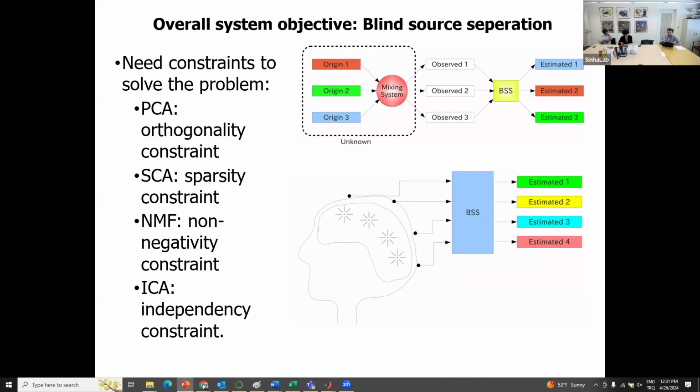In the sparsity constraint, your cost function is basically looking at the absolute difference rather than, for example, the squared difference. That increases the complexity of the problem and makes it non-convex, unfortunately. So that is part of the reason why sparse component analysis is a more complex technique compared to ICA.